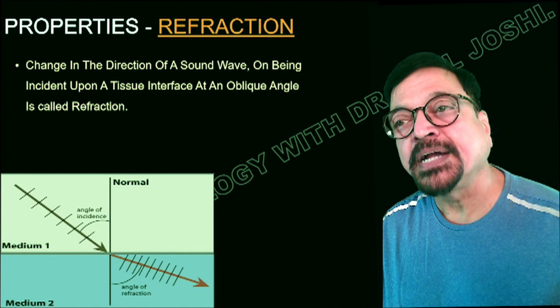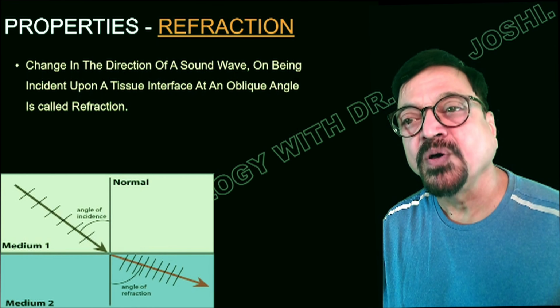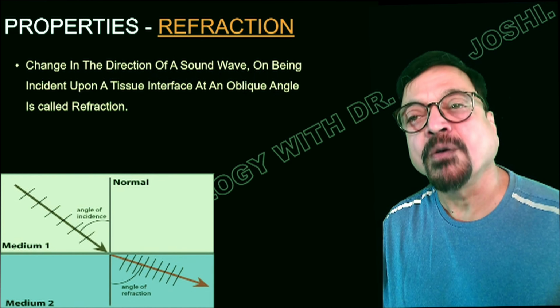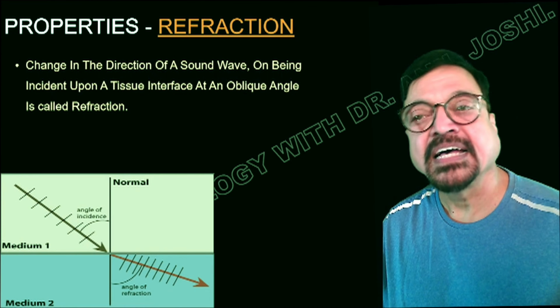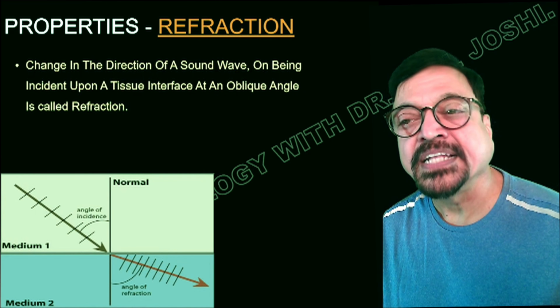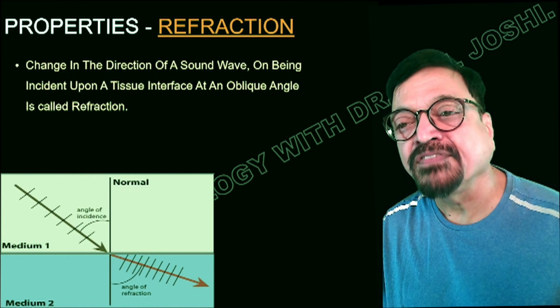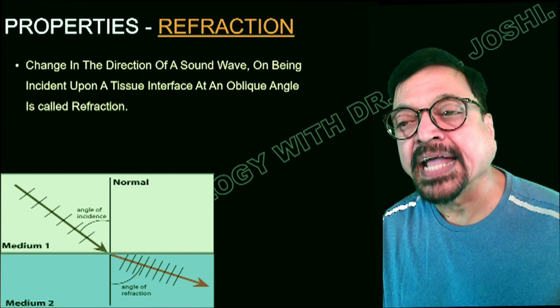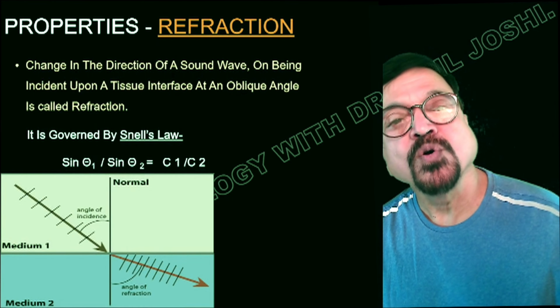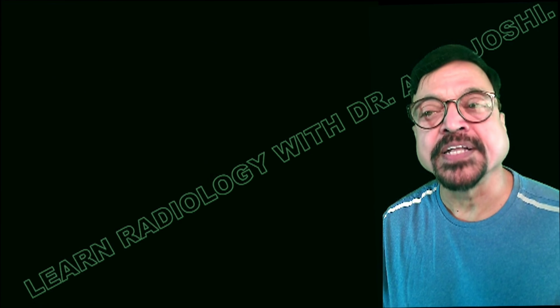Now, next property is refraction. Change in the direction of a sound wave on being incident upon a tissue interface at an oblique angle is called refraction. You can see in the diagram the incident ray, or incident ultrasound wave, how it is coming and it is getting deflected. That will give you an angle of refraction. Now, it is governed by Snell's law. For those who are interested, you can pause here and get a better idea of what Snell's law is.